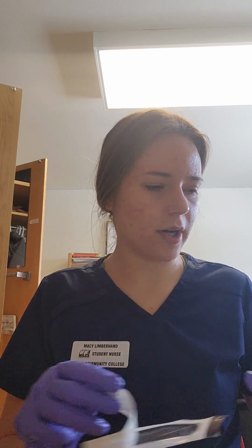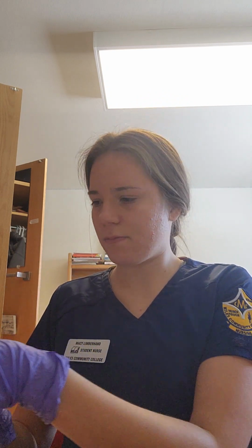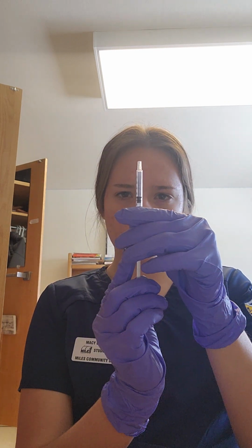So here I have a filter needle, and I'm going to look at my MAR again and draw up 0.5 mils of air. There we go. I'm just going to attach my filter needle. Set that aside for a second. Now I have just a regular piece of gauze, and I'm going to crack open my ampule, making sure everything's at the bottom.